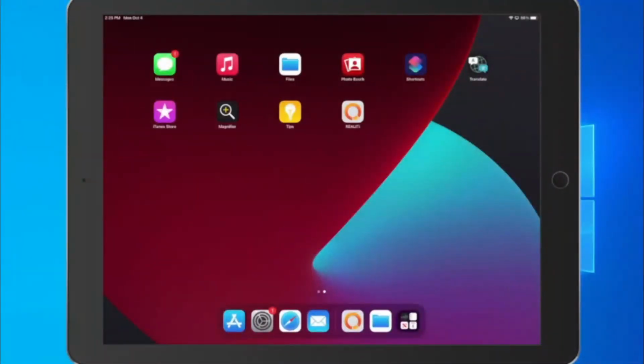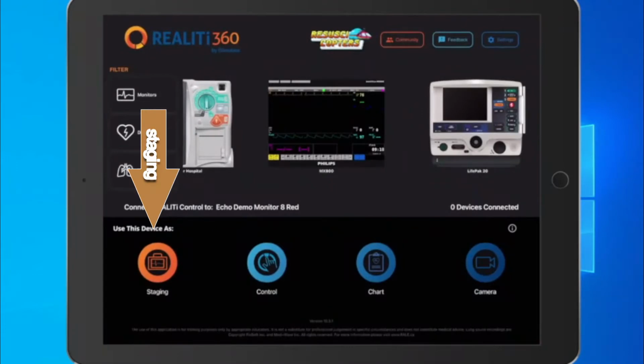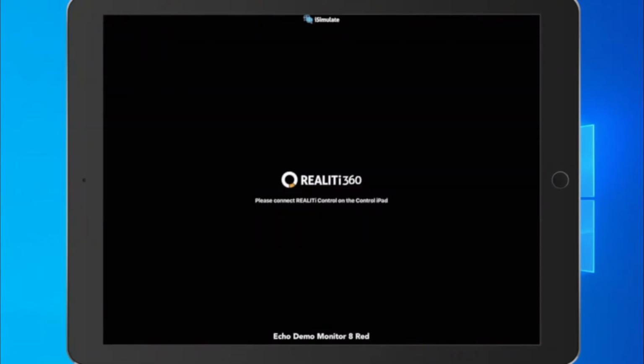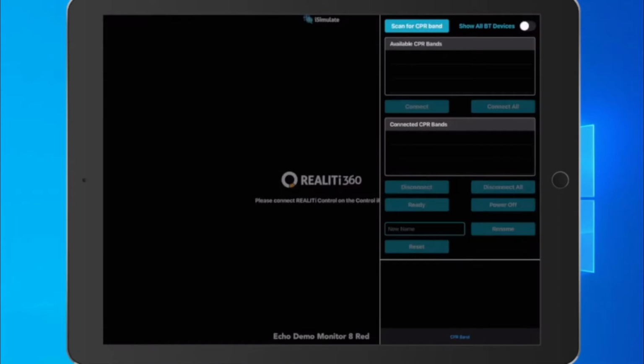In this section, we're going to show you how to scan for your bands. So I have the monitor on the screen right now. This is the participant monitor, the one that's in the iSimulate. You're going to make sure that your module is turned on, and you'll know that you'll have three flashing blue lights on your module. You're going to launch your Reality app. I'm going to put this in staging. And all I'm going to do is touch the screen and swipe right to left. And that should bring up your scanning for CPR bands.